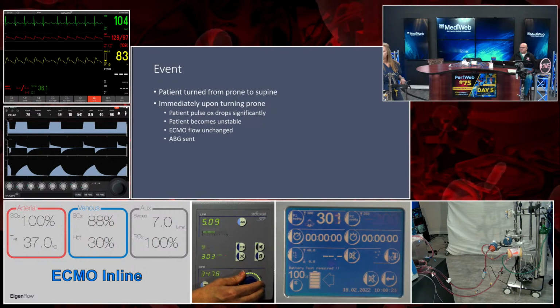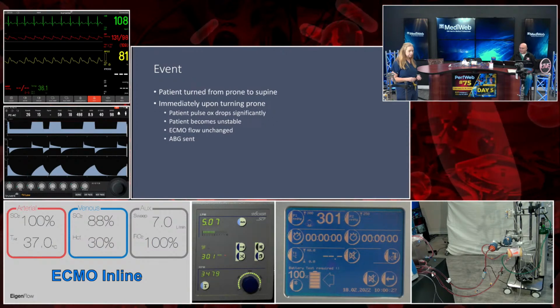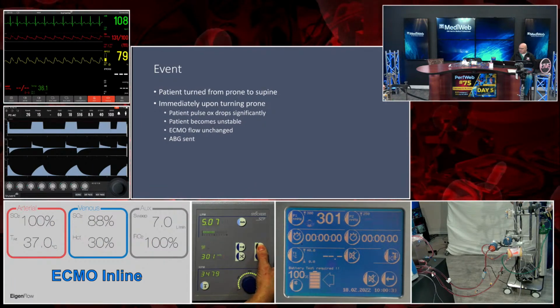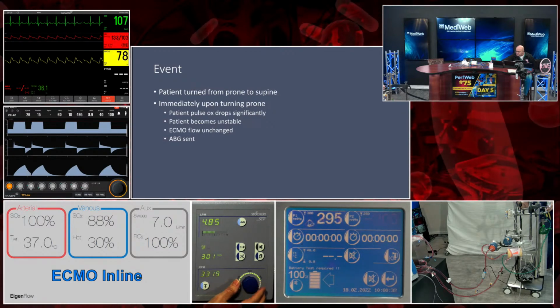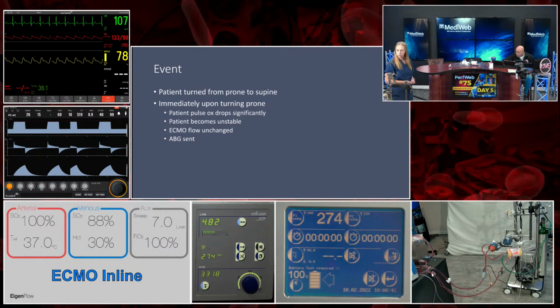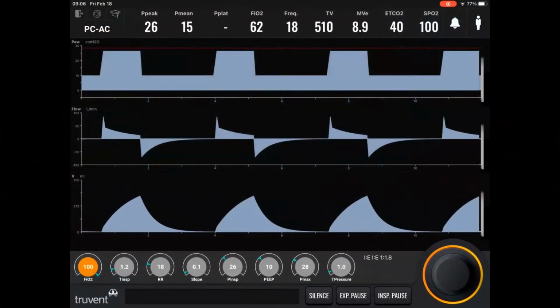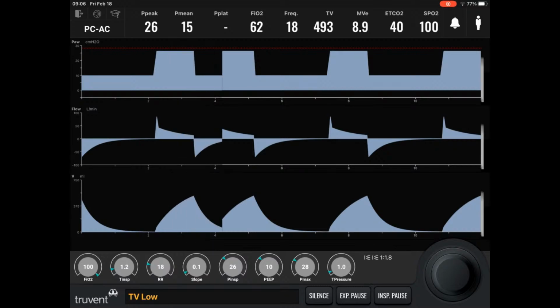Okay. Now it's starting to alarm because I'm maxing out on your RPMs. Right. So let's go ahead and silence the alarm so we don't have to go crazy. We can go to 100% on the vent. The patient does have pretty decent vent contribution. So let's go to 100% on the vent. Pull the vent up full screen, and they can see me changing the vent FiO2 to 100%. That would be a smart thing to do. I did that. Go ahead and bring that down.